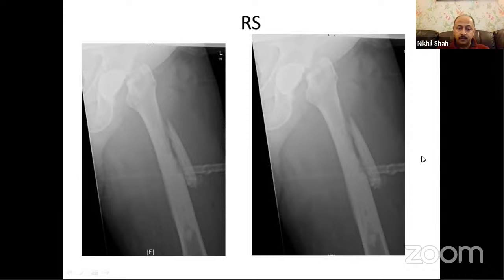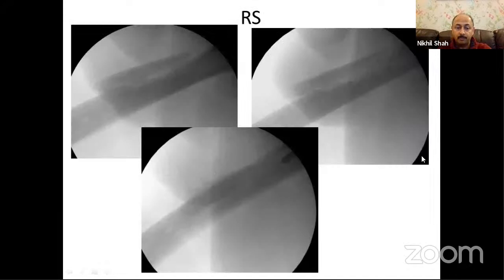So this was a cemented hip replacement. We are not quite sure what happened during surgery, but at some stage during the process of reaming and broaching, there was a big fracture, which unfortunately the surgeon did not realize. And he put cement into the femur to try and cement his stem. And when the cement started coming out of the fracture, that's when he realized that there was an intraoperative fracture. So thankfully, he did not put the stem in. This is the stage at which he called us. Surgery was abandoned and the patient was referred to us.